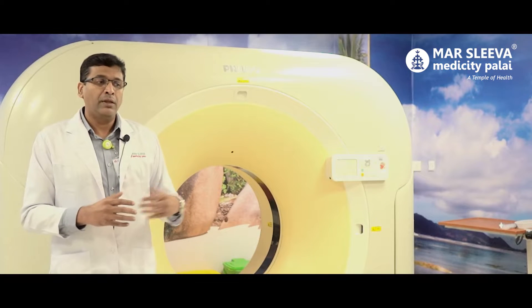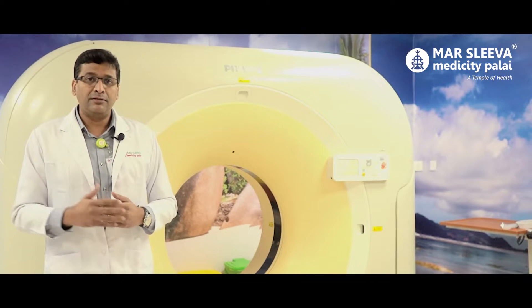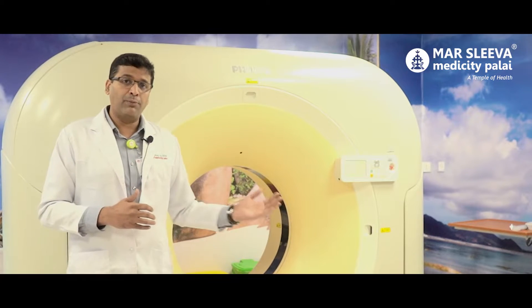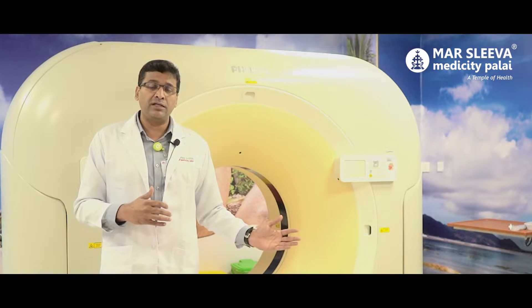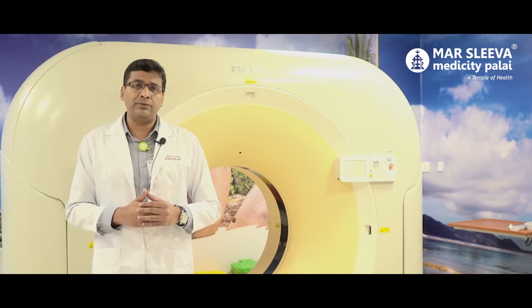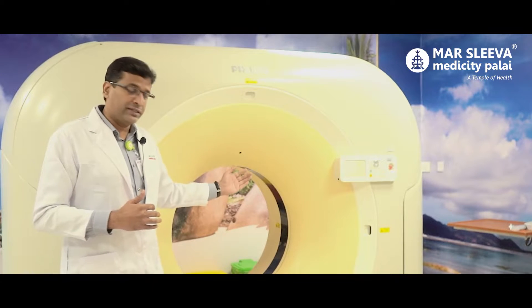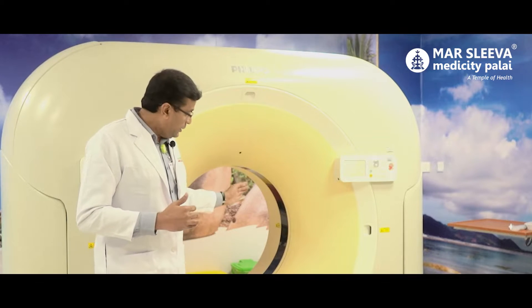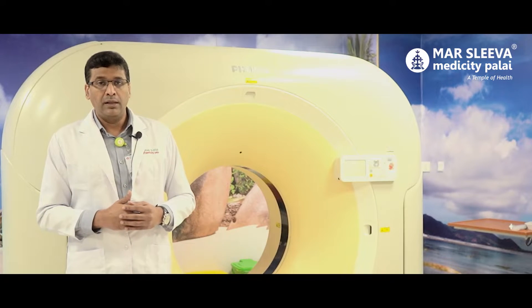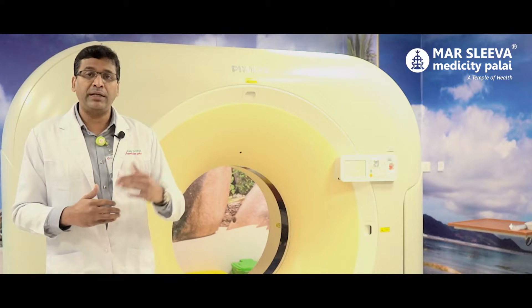We have progressed to multi-slice CT scan technology: there are 4-slice, 16-slice, 32-slice, 64-slice, and now this is a 128-slice CT scan. This is one of the newer generation CT scan machines. Here is the x-ray tube, and on the opposite side there are 128 detectors.